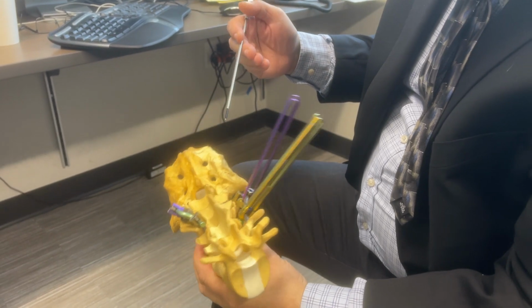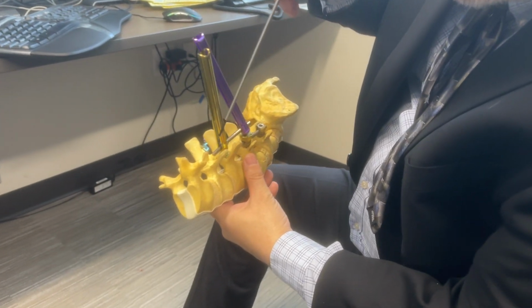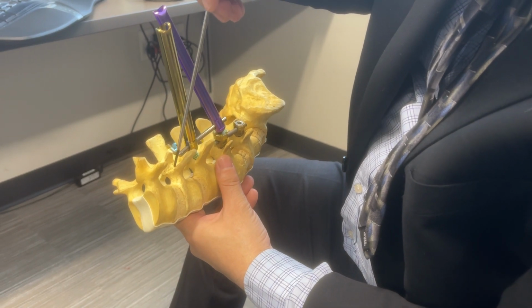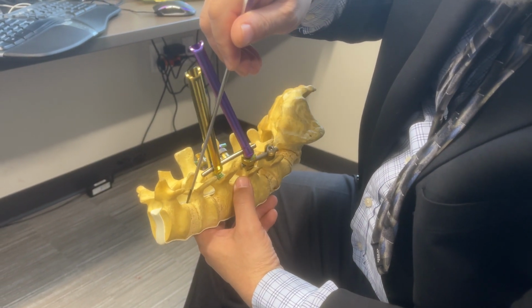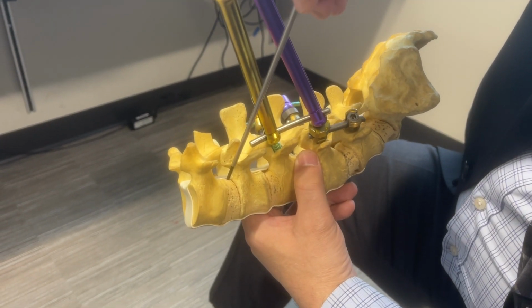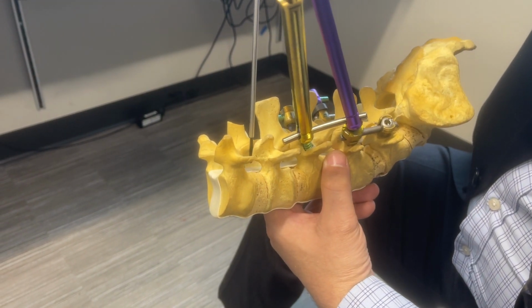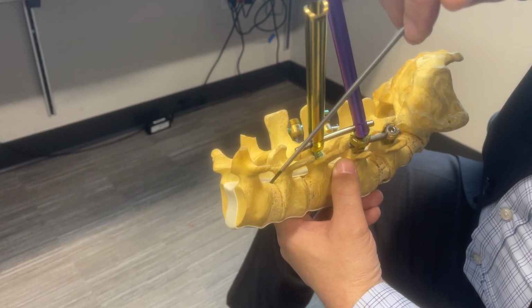In a Trans Kambin OLLIF, obviously I go from the left side here. I aim for the pedicle of the level below and I drop it in the Kambin triangle, which is exactly that. This is not transforaminal. You don't go through the foramen. We are extraforaminal, through the Kambin triangle.